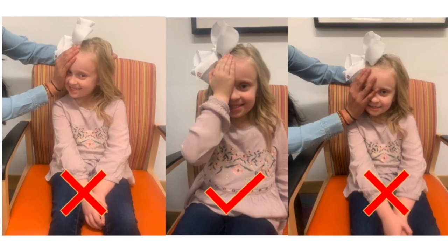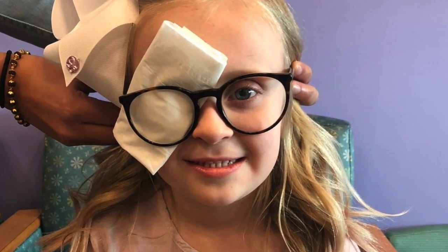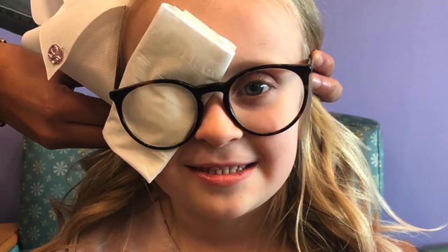If the child's old enough, they can cover their own eye. If your child wears glasses, you could occlude one eye with a folded tissue.